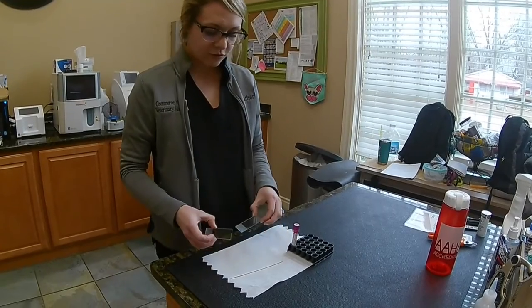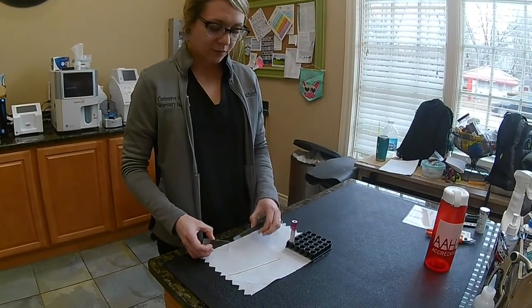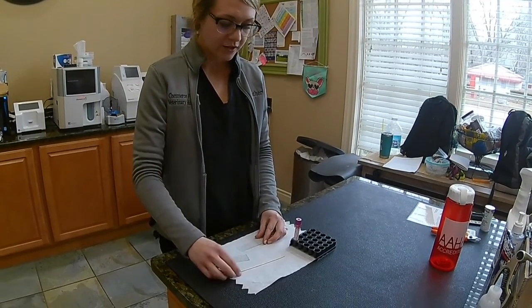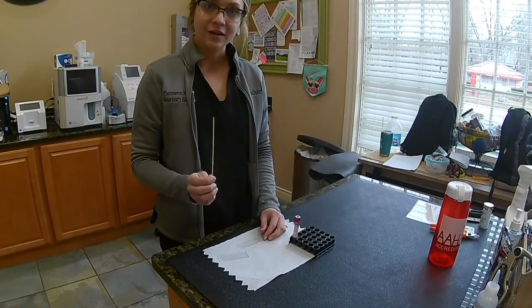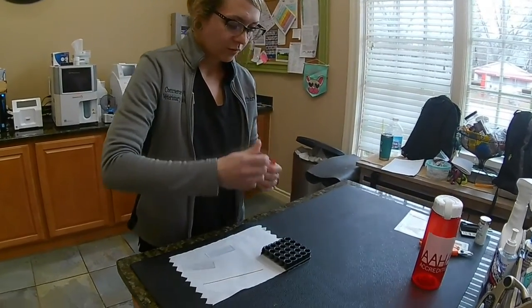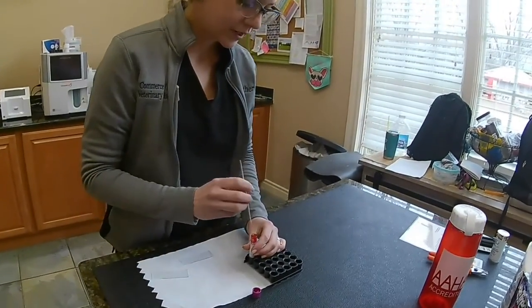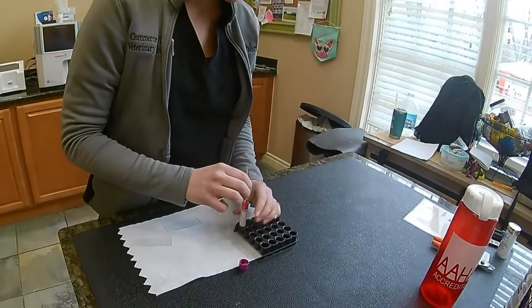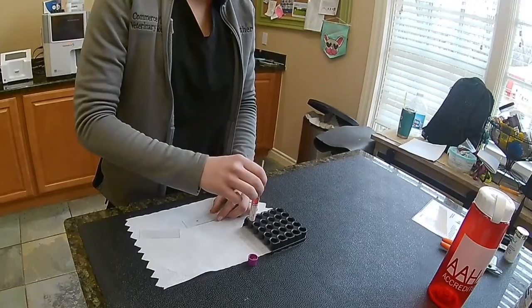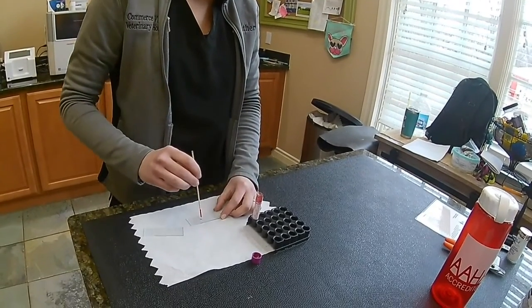I have 2 slides. One will be for the actual sample, and the other one will be for smearing the sample across that one. And then I'm going to use a wooden stick to apply my blood to the slide. So let's see, we're going to open it up. We're going to get a little drop of blood here. I'm going to dab that a little bit more.